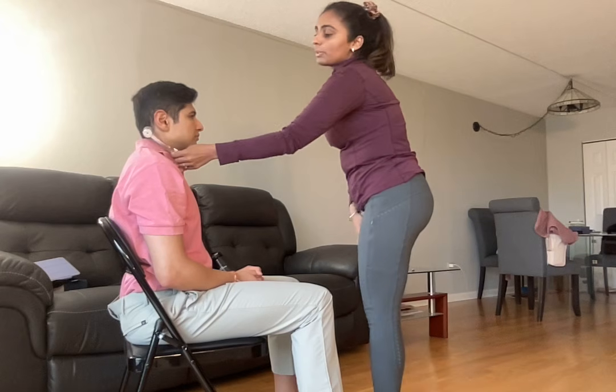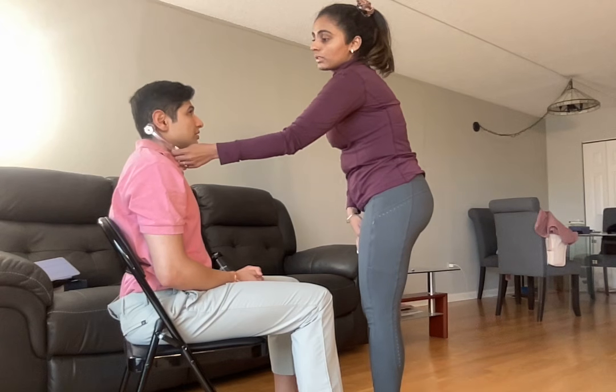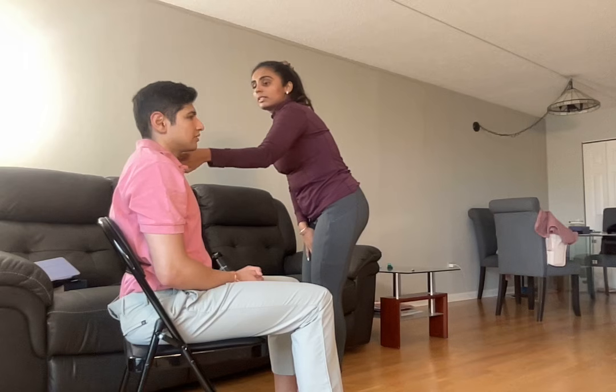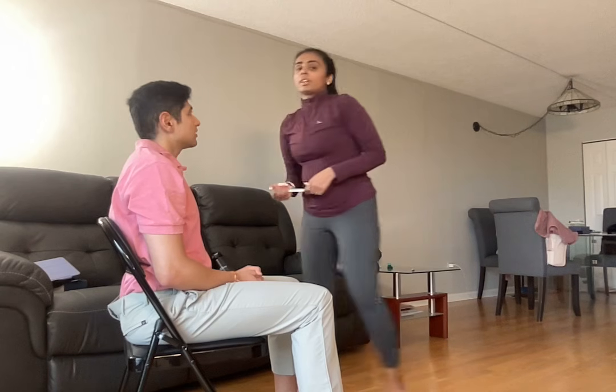Okay. And now we're going to check for bone conduction versus air conduction. Okay, so that's called a Rinne test. Tell me when you stop hearing the sound. Do you hear it? No, I don't. It stopped. But did you hear it? Yes, I did. Can you hear it? Yes, I do. Okay, so as you can see, it is a positive Rinne test.